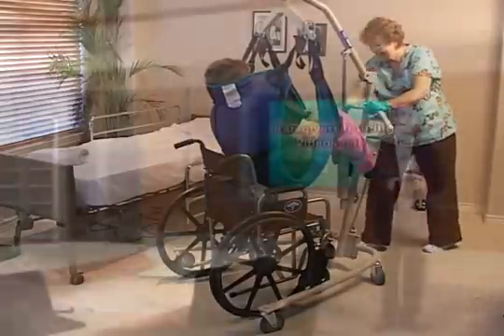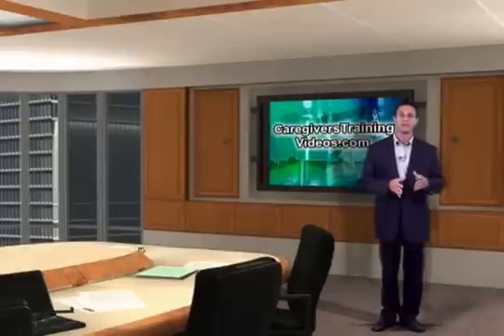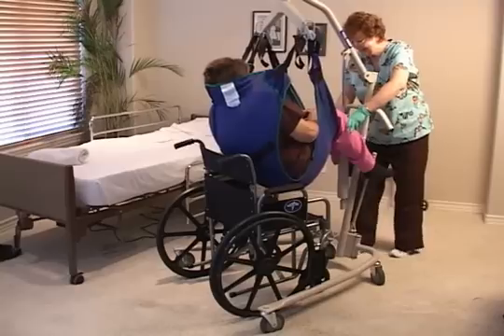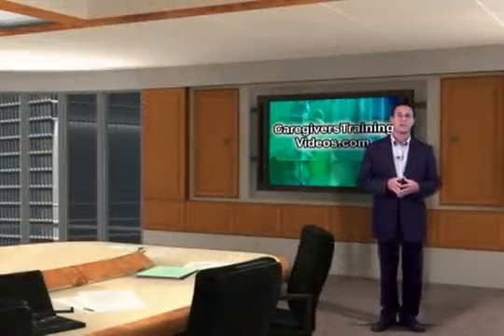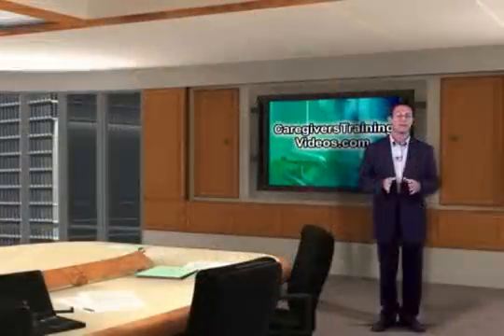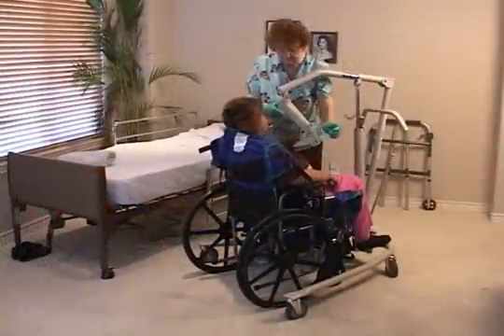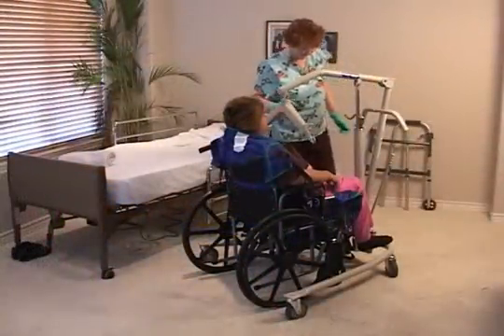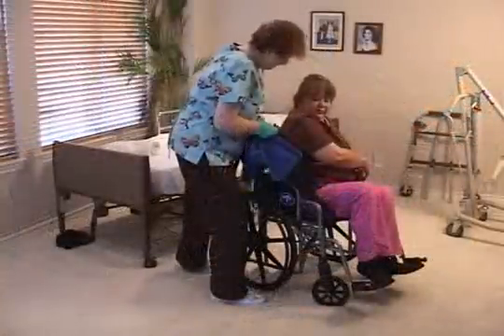29th, never pull or push the boom while the resident is secure to it. 30th, slowly open the control valve to lower the resident into the wheelchair. 31st, the resident's hip should be positioned as far back into the wheelchair as possible. 32nd, unhook the sling from the swivel bar and steer the hydraulic lift away. 33rd, safely remove the sling from the resident.